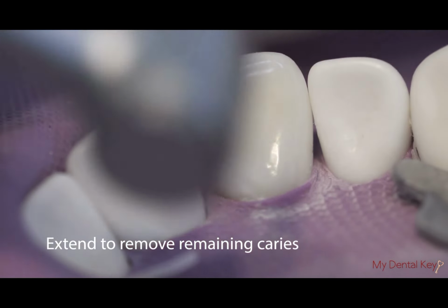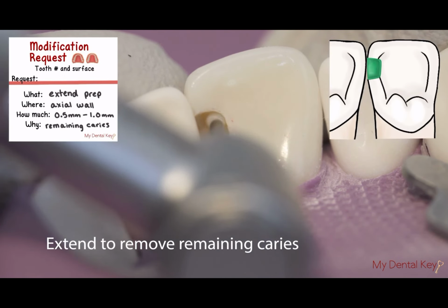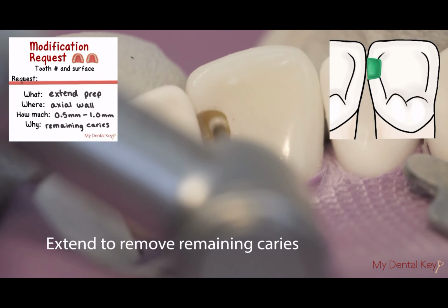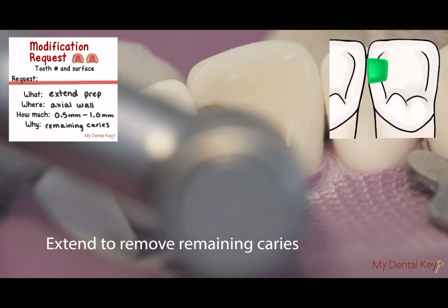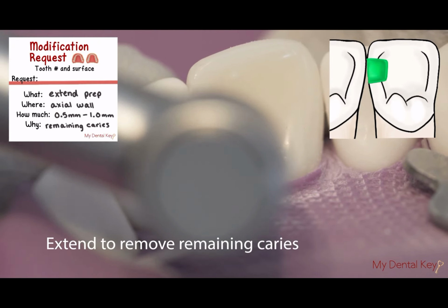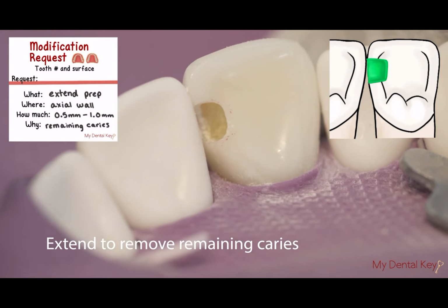As you continue to excavate the caries, keep in mind the ideal dimensions of the preparation. If you're excavating beyond these dimensions, be sure to request a modification to extend your preparation. For example, if you want to extend the axial wall towards the pulp, you can request that in your modification.